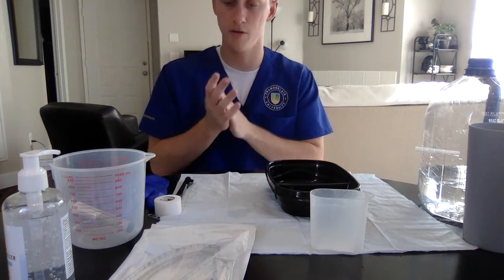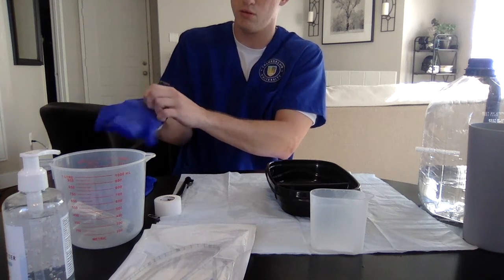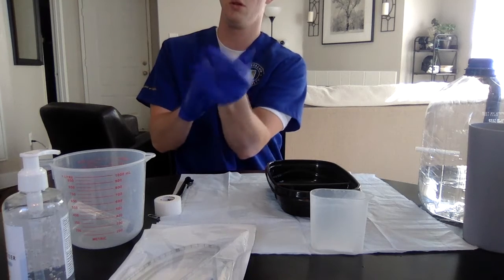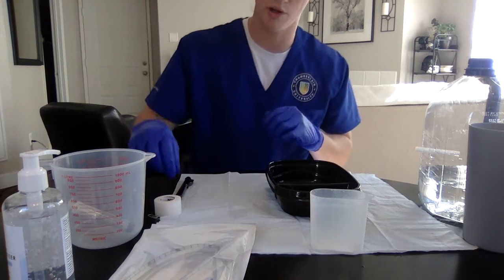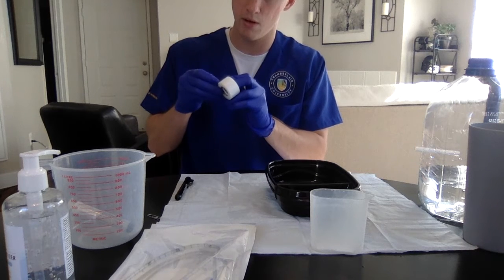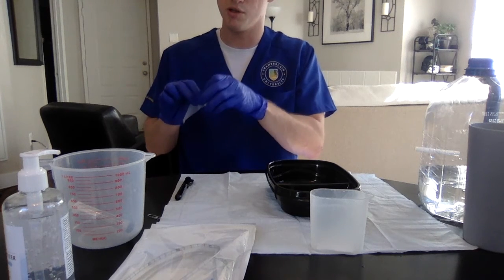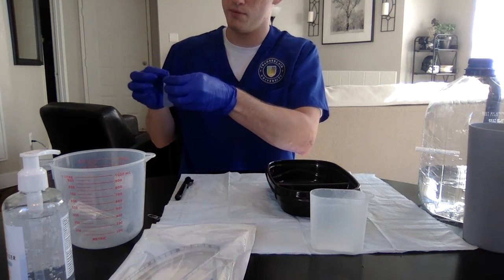So now the first thing that we're going to do is don our clean gloves. So this is not a sterile procedure. Now we're going to get everything else ready and prepared. So we're going to start with our tape here. Hopefully it wants to work with me. Alright, so we're going to do 2 pieces of tape about 3 inches, and one of them is going to be split like a pair of pants right down the middle.